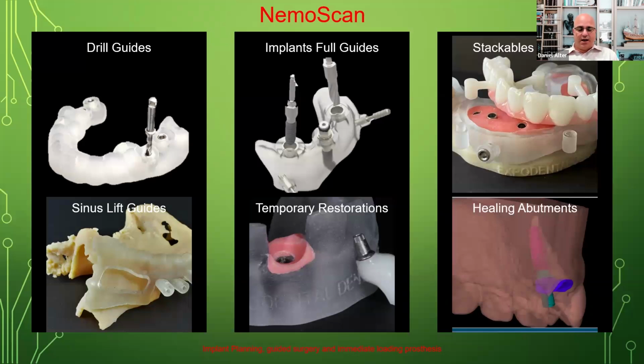Again, with these surgical guides, it's planned out so well and methodically that you can even take it all the way to the provisional step, that for lack of better terms, it's truly like holding their hand in a successful way. But the best part about it is that the general practitioner, you're creating a revenue stream for them that they didn't have before. And thereby it creates a revenue stream for you, and ultimately the patient benefits from it as well.